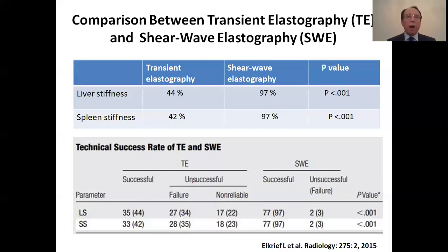By using MR elastography, a higher spleen stiffness and strong correlations between hepatic and splenic stiffness were demonstrated in patients with cirrhosis. According to current data, we can say that MR elastography in detecting portal hypertension is a promising method but needs further studies.